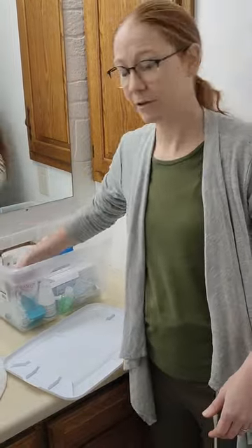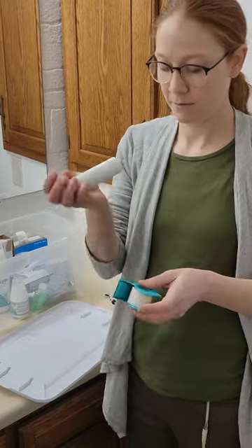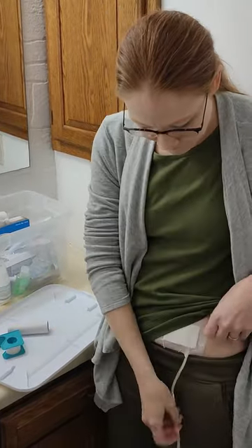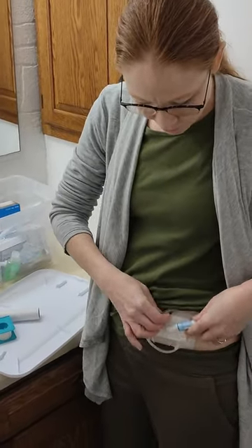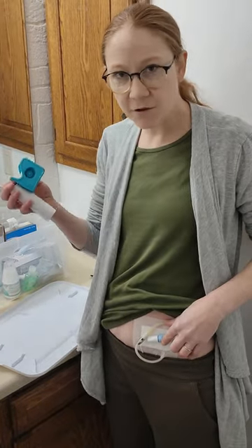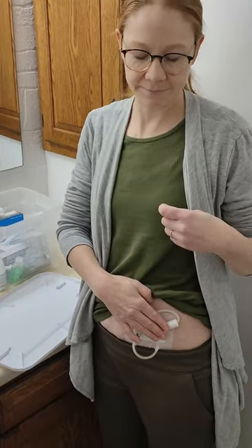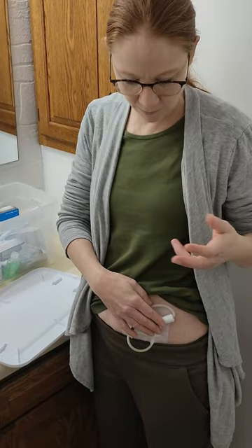Next thing I'm gonna talk about is what to do with your catheter. You can tape it up and kind of turn it around and just tape it — I've got the supplies for it, but I've never really liked to do that. I've got sensitive skin, and just the fact of taping and pulling it off is not something I want to do.